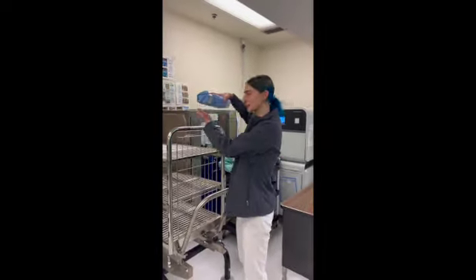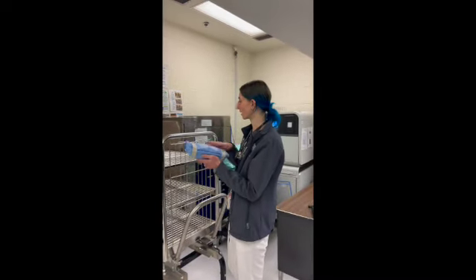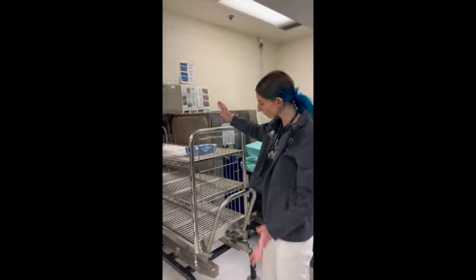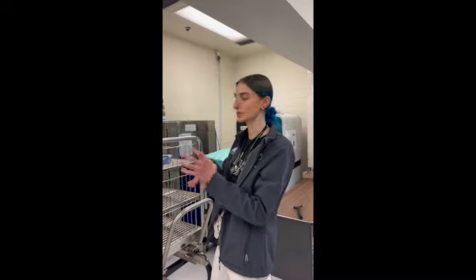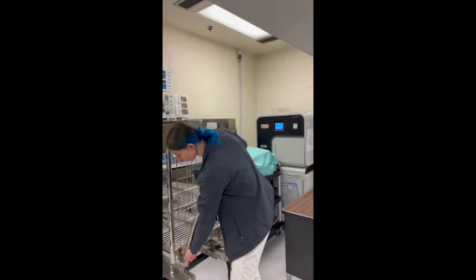Alright, so this is our autoclave. It's very big, but here's our wound pack. This is the stand that we're going to set it on. So this is what we're going to push into the autoclave. When you're putting the packs in the autoclave, you want to make sure that you're not stacking them on top of each other. You're making sure that there's room for the steam to flow in between the different packs. And so now we'll just insert this into the autoclave.